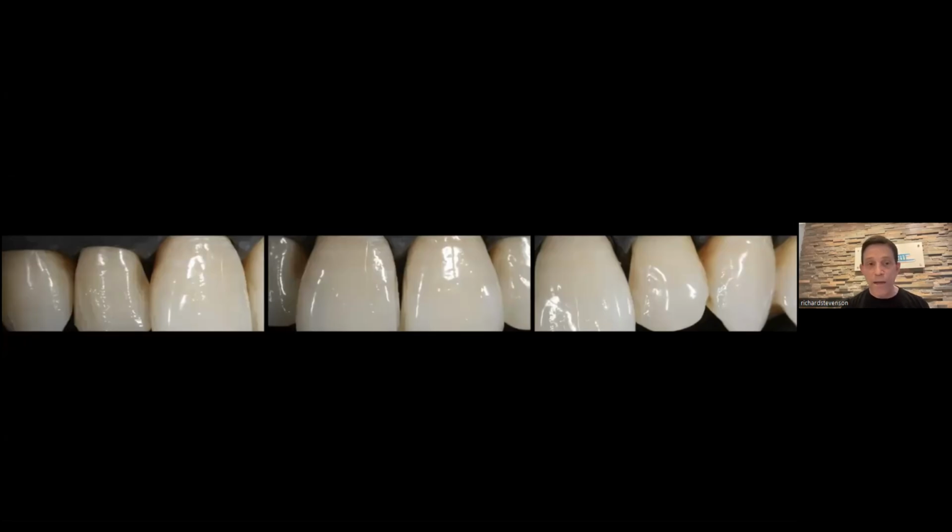So you can use BioClear. You know, David Clark's got a great product. I think it works really well. But it's not, I think, as good as what you can do when you hand sculpt, like I'm going to show you here. Rubber dam was absolutely essential. The rubber dam is going to retract the papilla out of the way and allow us to build back in our porcelain and our composite in this case, and it's going to allow us a clean environment in which to work.